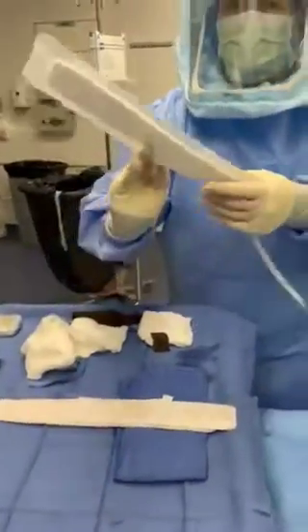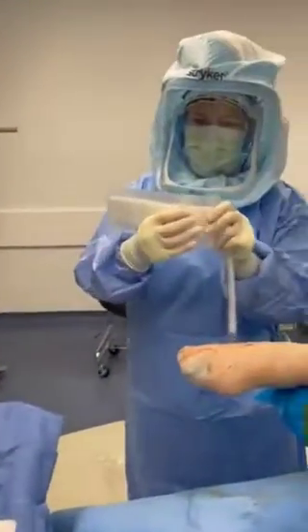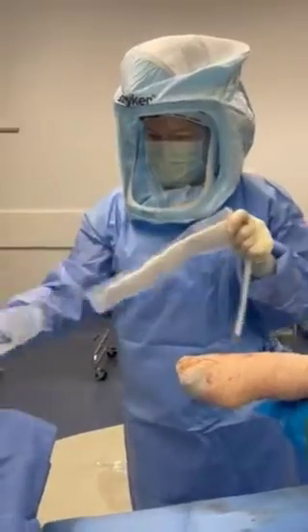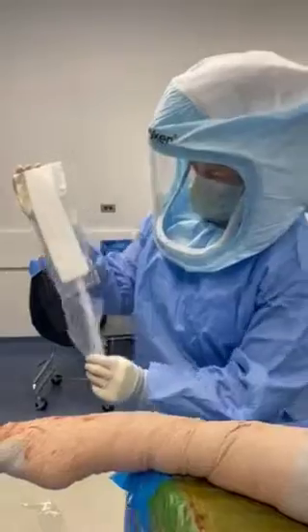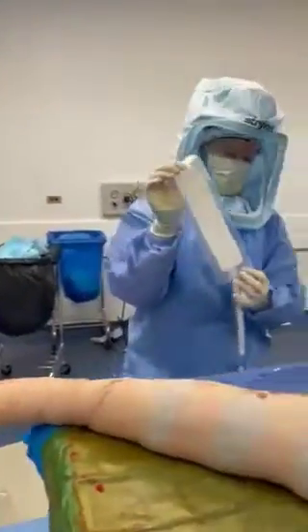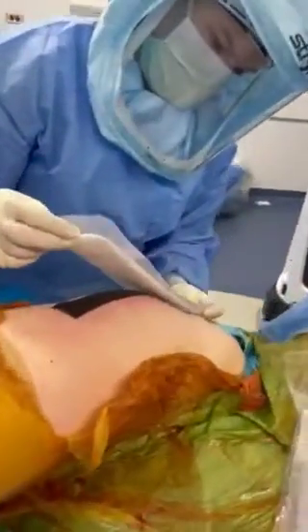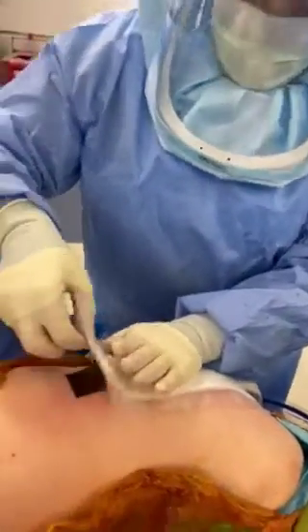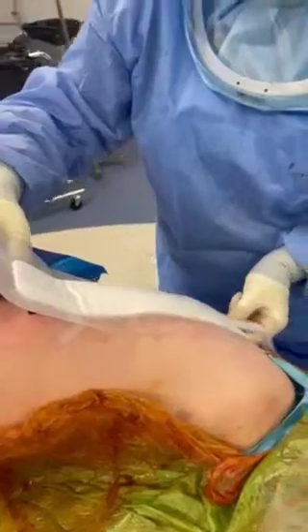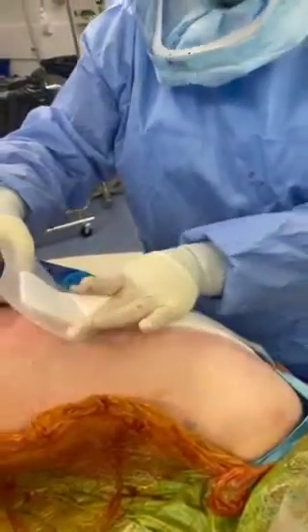So I'll take the PICO here. I like to take off this middle peel away strip first. Then I come down, pull the second strip. We always go port side proximal so that it's easier for the patient to hold the battery pack in a pocket. So then you smooth that down. It's nice silicone, so it's easy to maneuver.